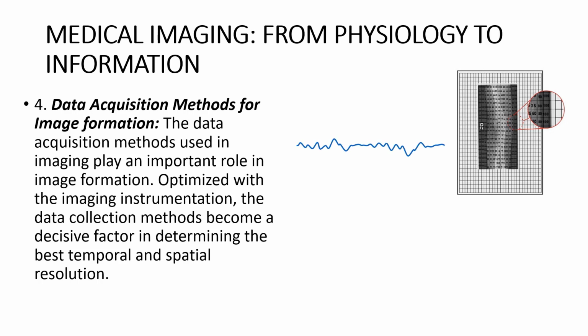Let's look at imaging data acquisition methods for electronic images. We have entire programs dedicated to just this subject, so we'll do a very brief cursory overview of digital electronic imaging. If you'll take a look to the right, you'll see the image of an elbow. That image is superimposed over an active data display image receptor. You'll note that the area that we're doing the image on has been collimated to. So the computer will only look at that specific information within the boundaries of the collimator to gather the data that it needs to create an image. The image will not appear as an elbow as it does here, but as you see to the right, intensities. So we're recording signal intensities.